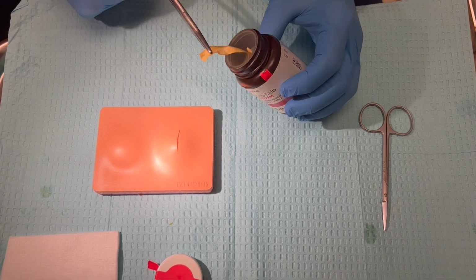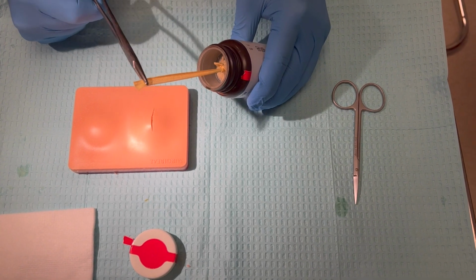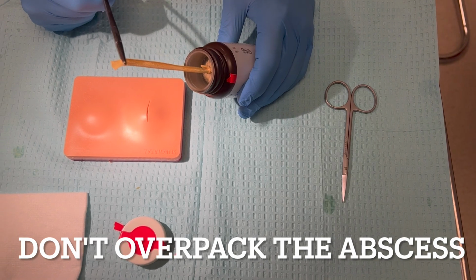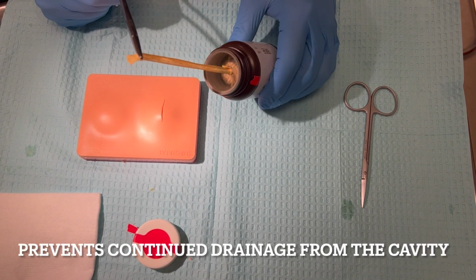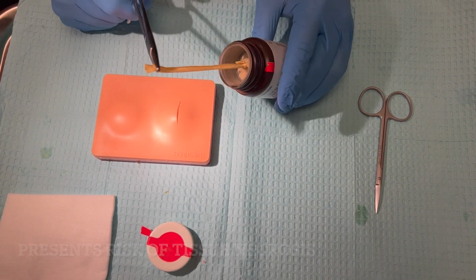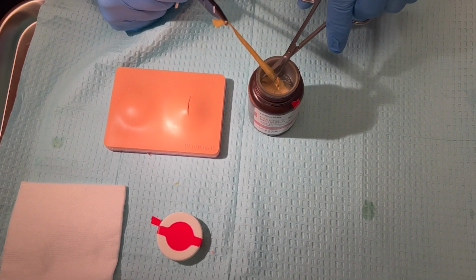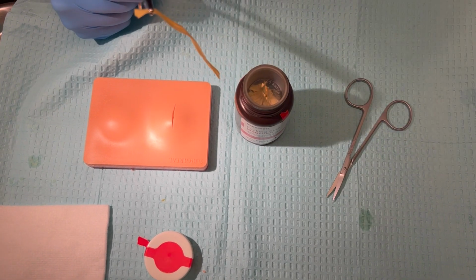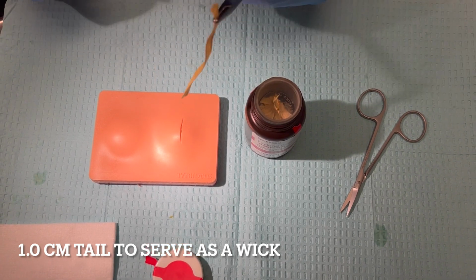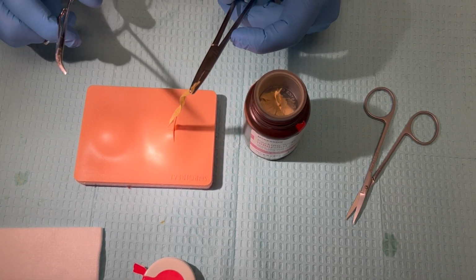This is iodoform packing. Iodoform is an antiseptic and can also help against further infection. As we pull this out from the bottle, we identify that we don't want to overly pack the abscess. If we pack the abscess too tightly, it can prevent continued drainage and can result in tissue necrosis from excessive pressure within that cavity. The ultimate point of packing is to keep our wound open. We'll cut this out. We're going to want to leave a total of approximately 1 centimeter of packing outside of the tissue as a wick to allow for continued drainage and something that we can grasp when the patient returns.